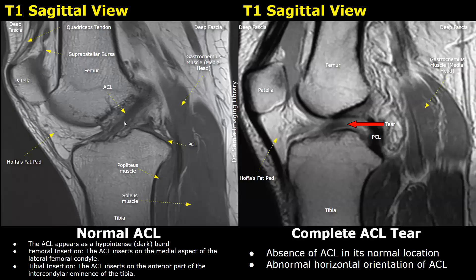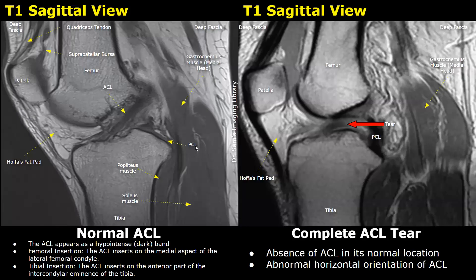This fibrous hypointense dark band is the ACL. It inserts on the medial aspect of the lateral femoral condyle. Its tibial insertion is on the anterior part of the intercondylar eminence of the tibia at the tibial plateau. We can also see part of the posterior cruciate ligament — the PCL — which is posterior to the ACL.